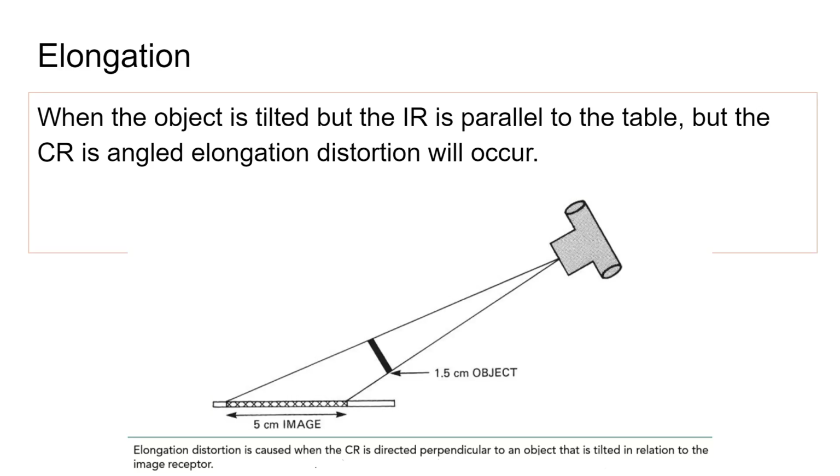This is what I was explaining. I'm sure other clinical instructors have the same problem. Sometimes I'll ask the radiologist or the med student or whoever is fluoroing to allow the student to do the overheads. My dilemma is, one, if they didn't need them to begin with, then I'm overexposing the patient, right?